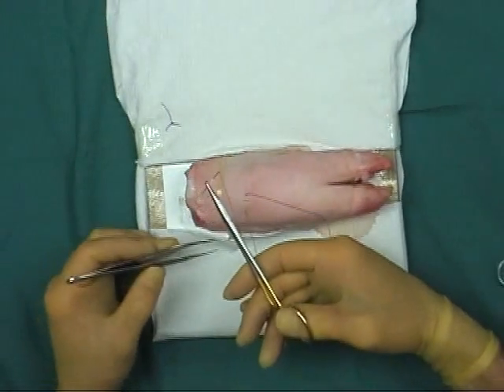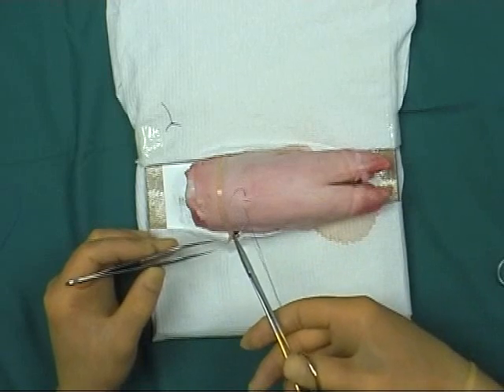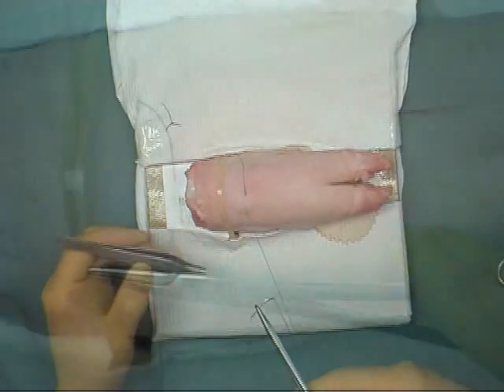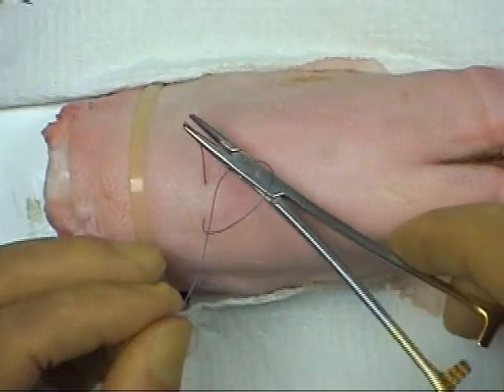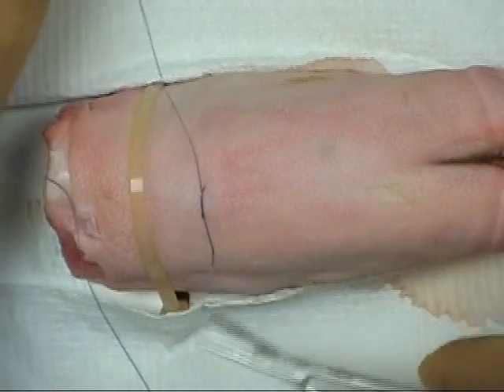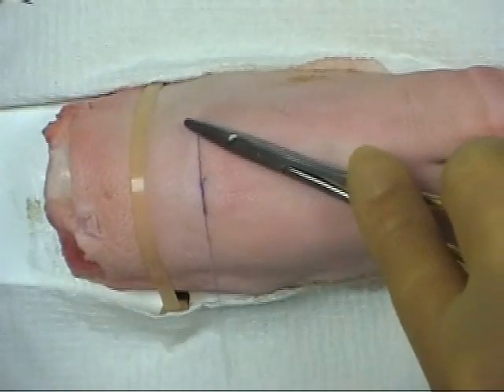As the suture is pulled through, it is essential to keep the needle in view. You can either use the forceps to pull the suture or use your little finger to take up the slack. The suture is then tied using an instrument tie. Form the knot on the side of the wound so that it does not interfere with the healing process.